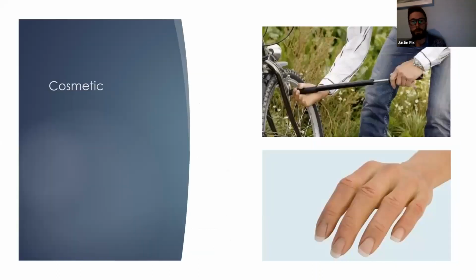If we're looking at upper limb, we can pretty much look at cosmetic options. This is just trying to make it look like a natural arm and hand. Because there are no functional elements to this prosthesis, they are obviously very lightweight, and they're very well suited for high amputation levels.